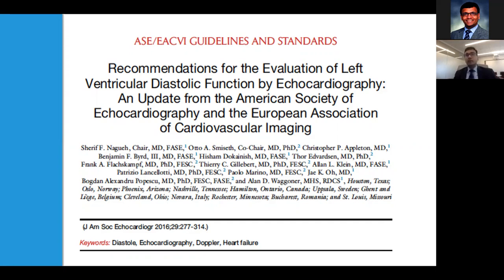And it also clearly states that systolic and diastolic dysfunction are closely connected phenotypes. To a great extent, a simplification of the proposed schematics happened. There is further work currently going on for improving the classification of diastolic dysfunction.